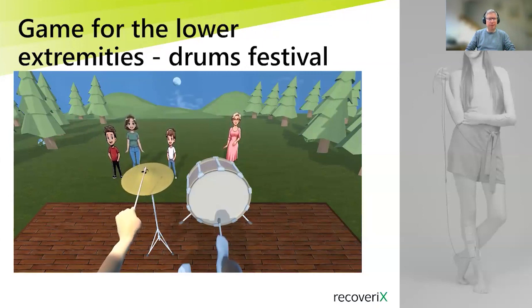This is again a left-hand trial doing the left-hand motor imagery. And all these trials are successful in this video. You may have recognized, we have here a small audience of 4 people. And just in the beginning of the video, there was this boy appearing. So this is also a kind of positive feedback, a score.